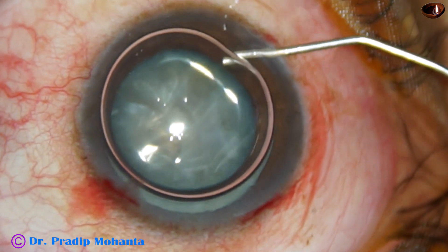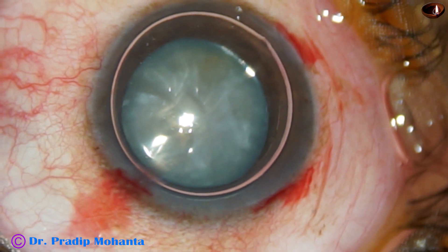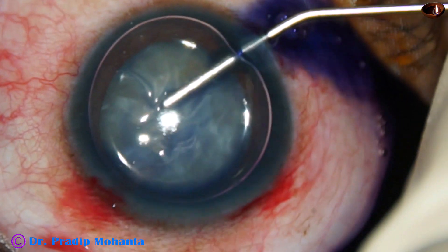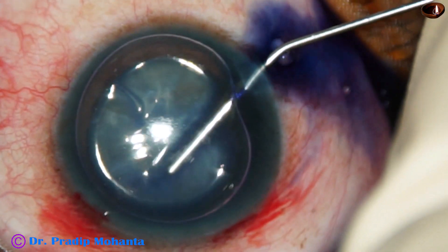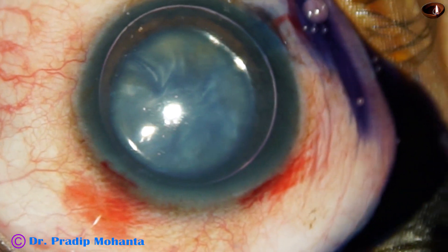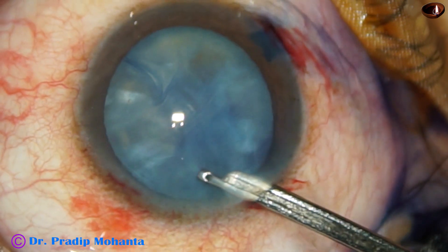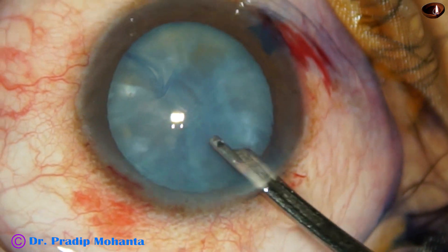Now an air bubble is injected. Underneath this air bubble, trypan blue dye is applied over the anterior capsule. As the dye is applied, we can see some wrinkling of the anterior capsule and we can very clearly see the fibrous bands just underneath the anterior capsule. The anterior capsule is adherent to this fibrous sheet. The dye is then washed out.